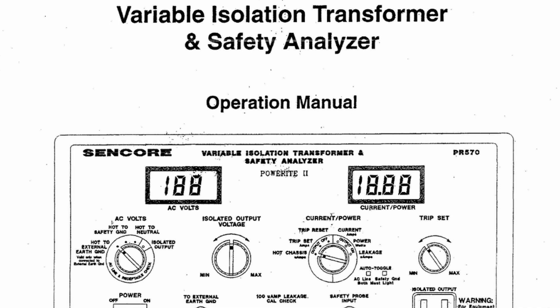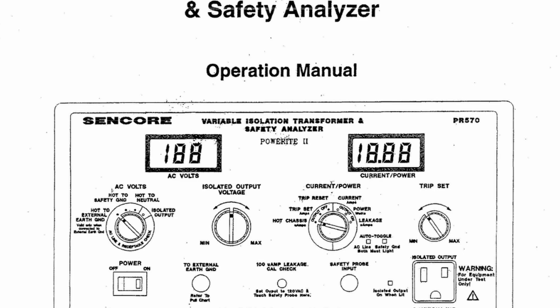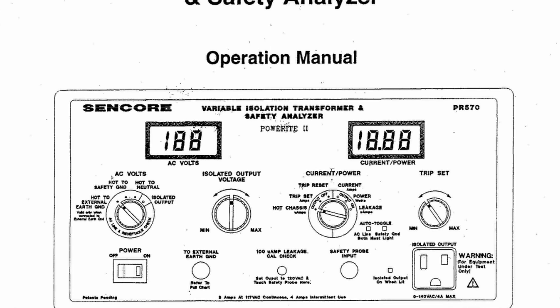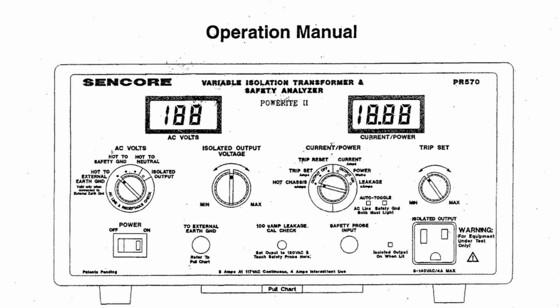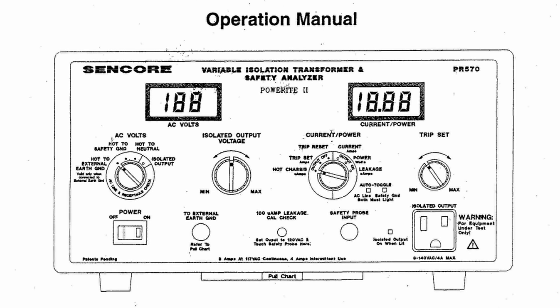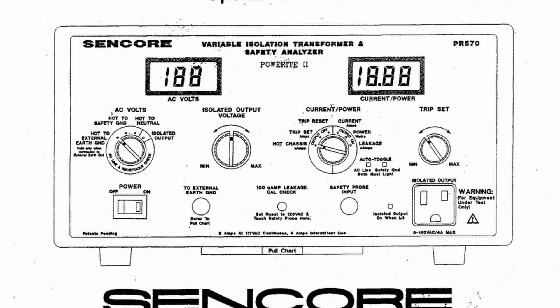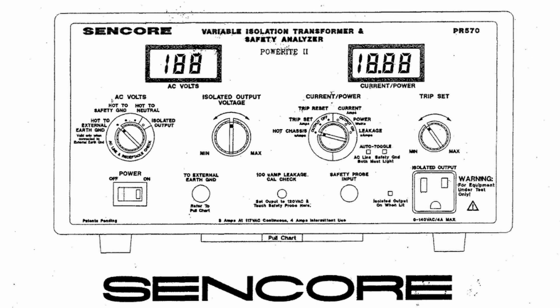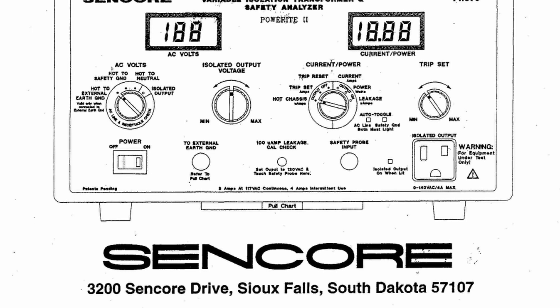I purchased one off of eBay. I got it for pretty cheap. It said there were some issues with it — sold as-is for parts, no returns. We'll see what we can make of it today. One thing I noticed in the pictures is there was something funny with the isolated output voltage knob, which runs the Variac in the back. So we'll pull the cover off and see what we've got.